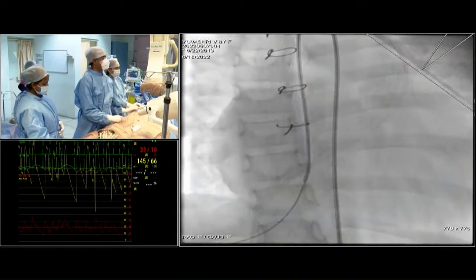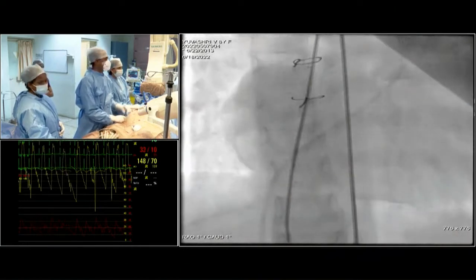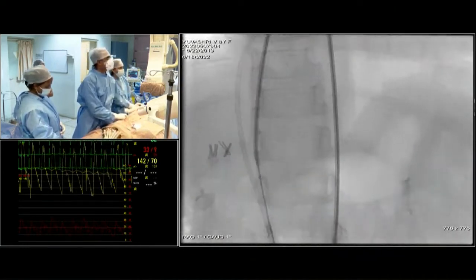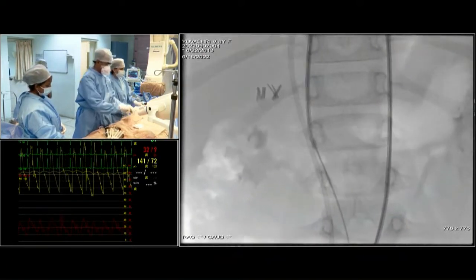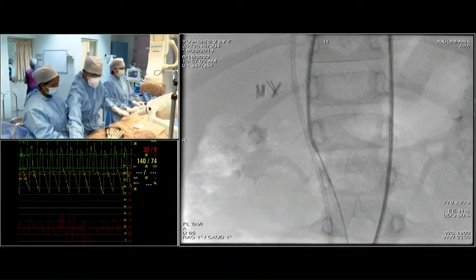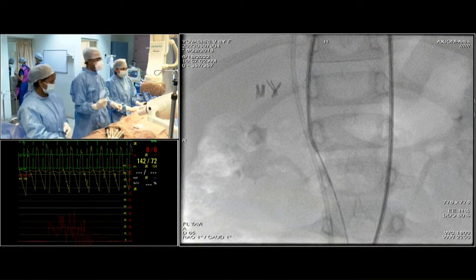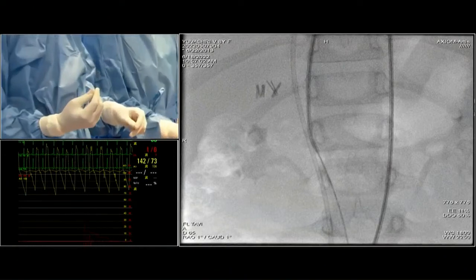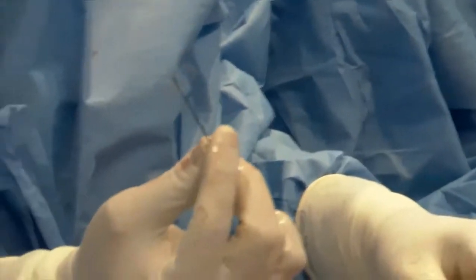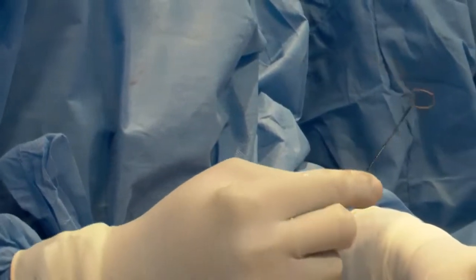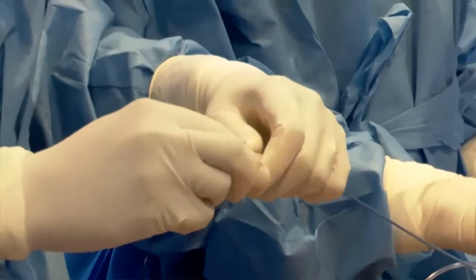Use the hepatic approach as far as possible — we don't want to get trapped in the tricuspid valve. It looks like a straight path. You can appreciate the catheter is away from the tricuspid wall. A useful tip: if you place the catheter such that it goes into the IVC, that confirms you are not trapped in the subvalvar apparatus — this helps in VSD or this kind of intervention.